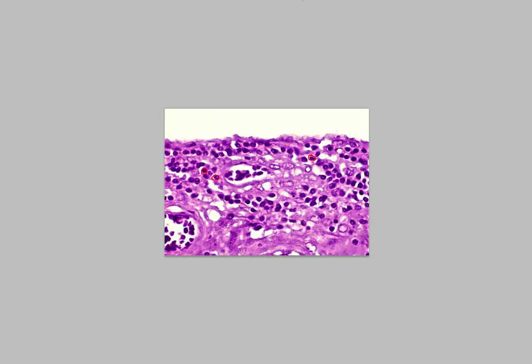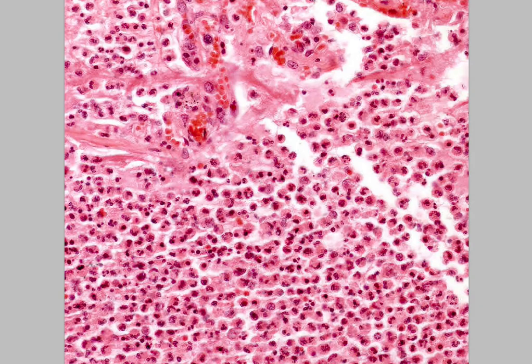So it really works. Again, you have to be zoomed in to some extent to see this, but this is the primary method. So I'm going to ask you, what do you think this inflammation is, acute or chronic?